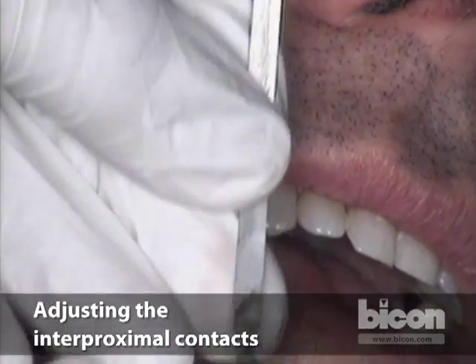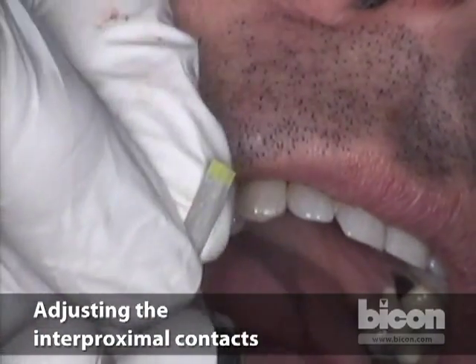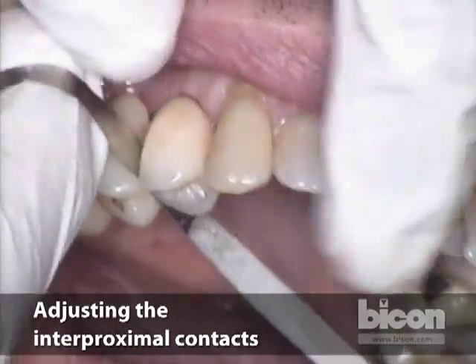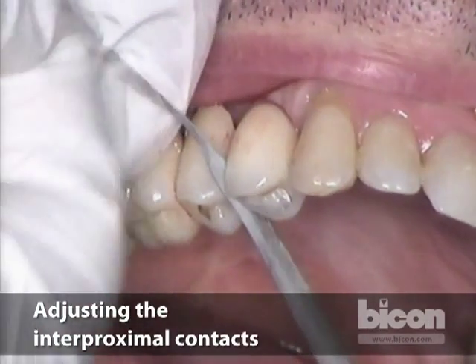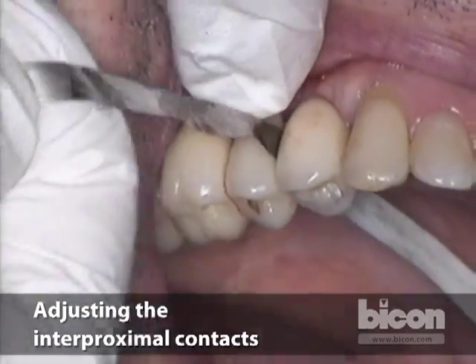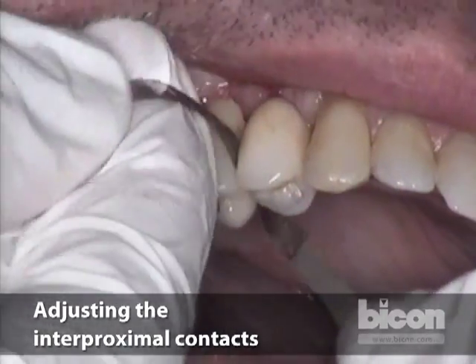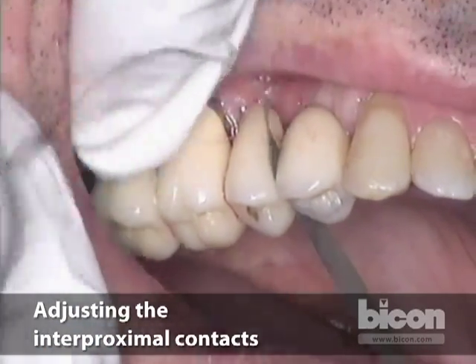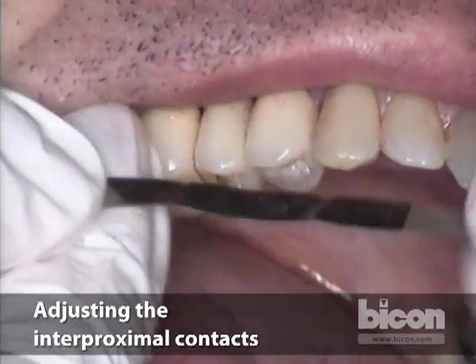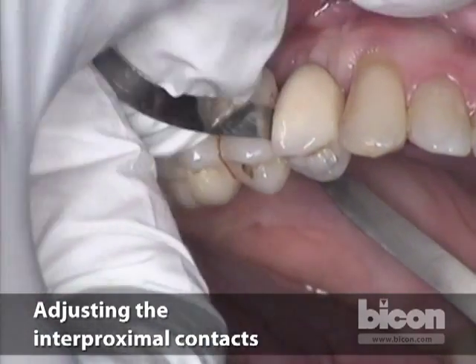I like the yellow diamond strips — they're really fine diamond strips. I place it in the distal area, get it in and move it around the interproximal contact. This particular yellow one is so thin that you can use it many times and it doesn't really remove the interproximal contact — it just makes it perfect. You have to make sure you protect the patient's lips because this diamond strip loves to cut lips.